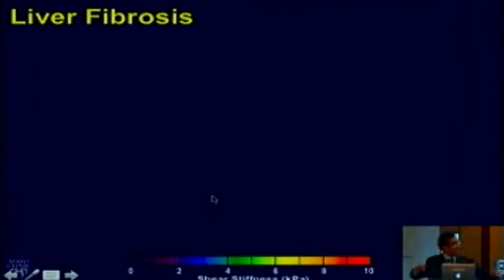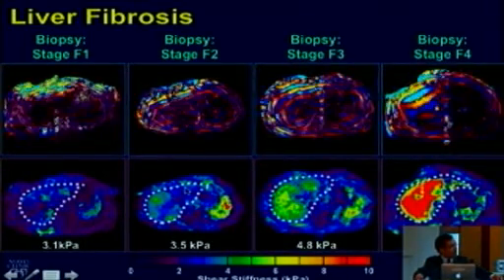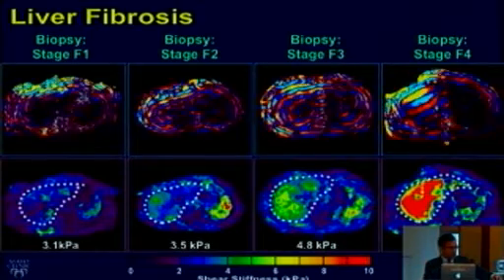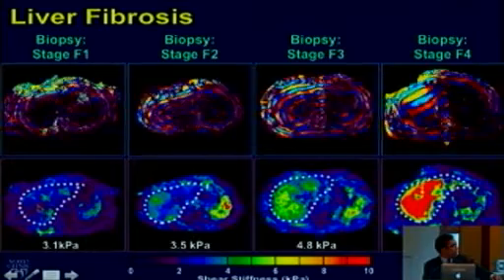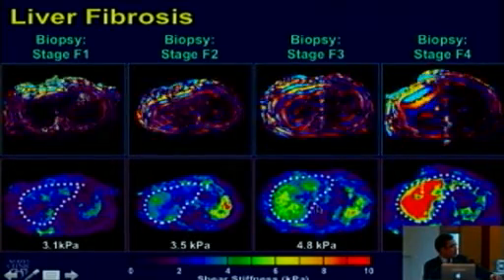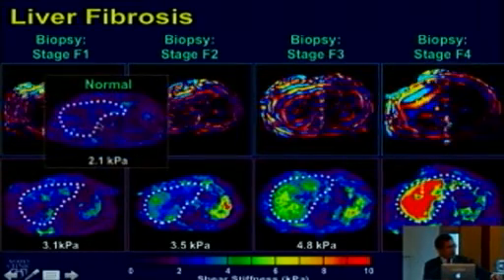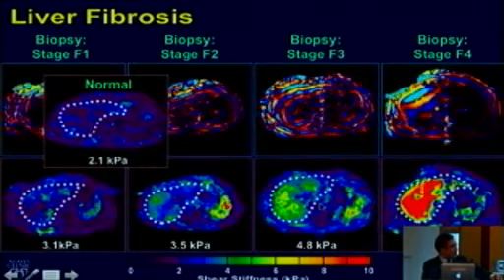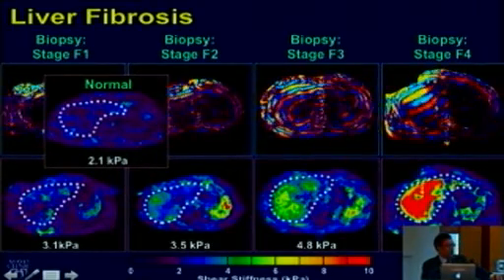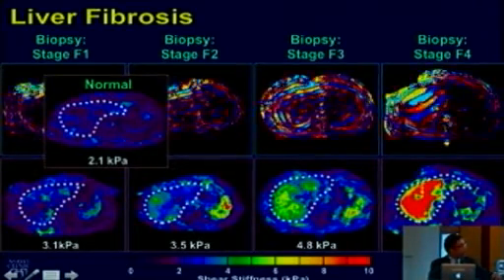And we have also seen that as the stiffness of the liver or the stage of the fibrosis increases, the wavelength of the shear waves going through the liver increases, and this is reflected as we see over here, the change in the color of the liver in the stiffness map from blue, purple to going to green to orange, and finally to the red. This is in contrast to a normal liver, which is usually purple and blue in color. And normal liver is usually less than 2.5 kilopascal, and the liver, as you can see over here, is 10.8 kilopascal, which can go up to 20 to 30 kilopascals if it is very severe.